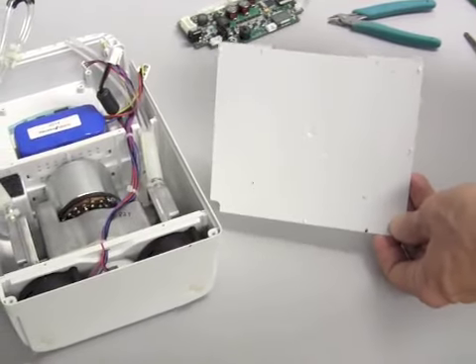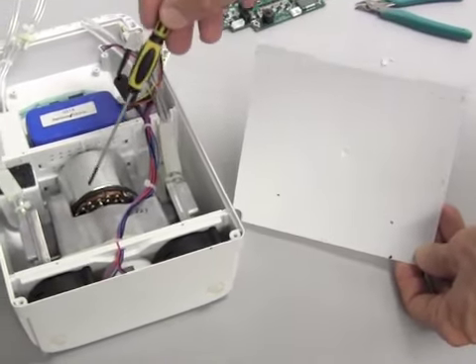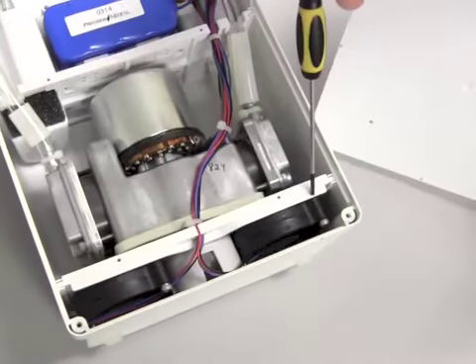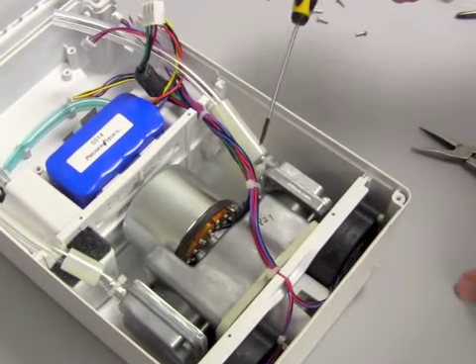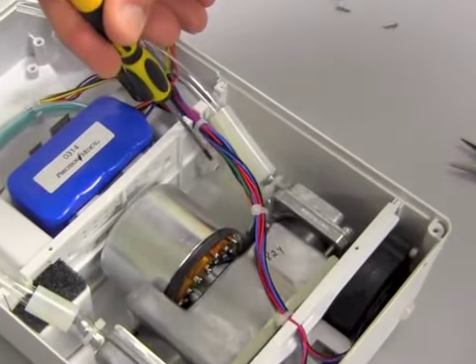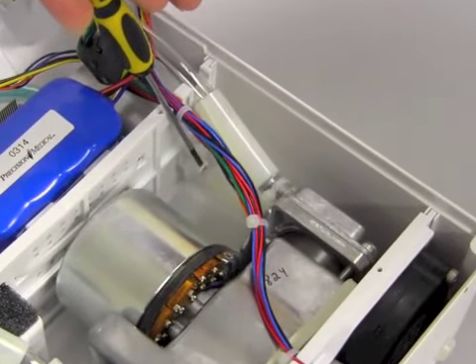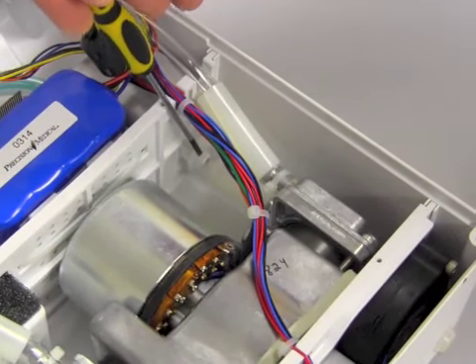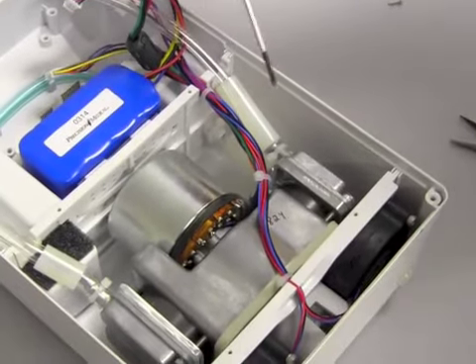I have removed the plastic plate by taking out the 4 Phillips head screws. This now exposes the compressor assembly and the fan assembly. To remove the compressor assembly, the first step is to cut the wire tie that is on the Tygon tubing, the lower Tygon tubing, where the screwdriver is pointed at. Once this is cut, then the compressor assembly can be pulled out of the POC.